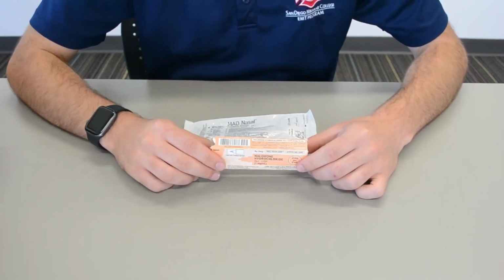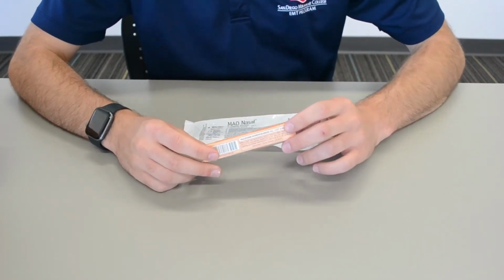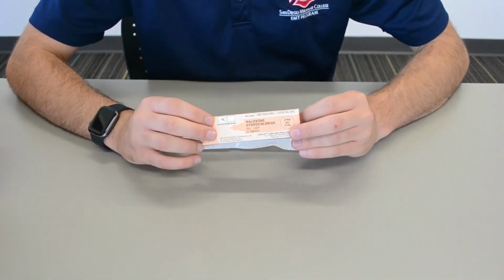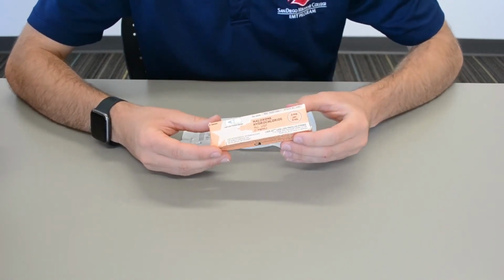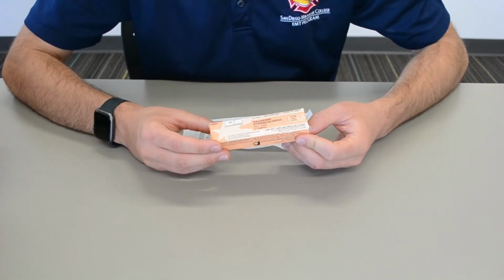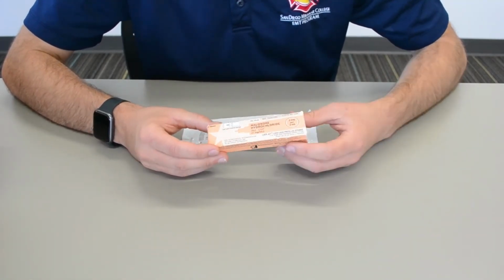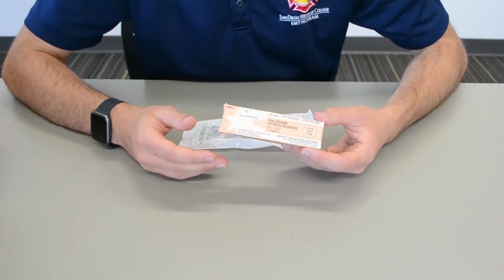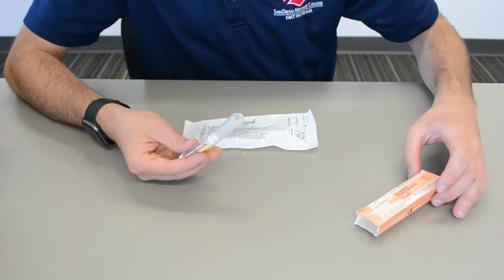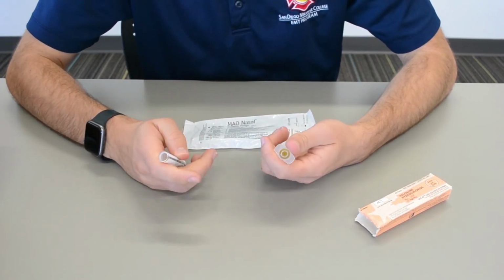And if you look at the expiration, you're going to see it on the box for the medication, as well as the vial, so you can check that. This medication actually expired February of 2017, but for our purposes, let's say that it's all good to go and the 5 rights count.